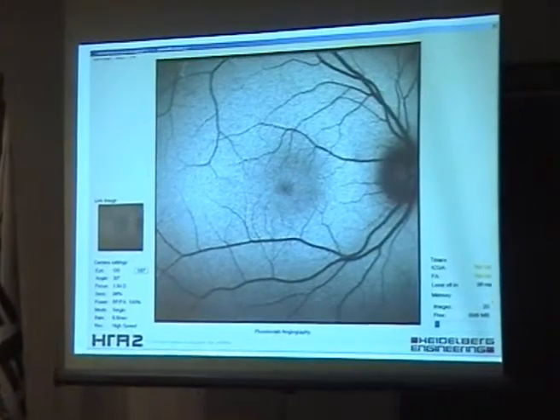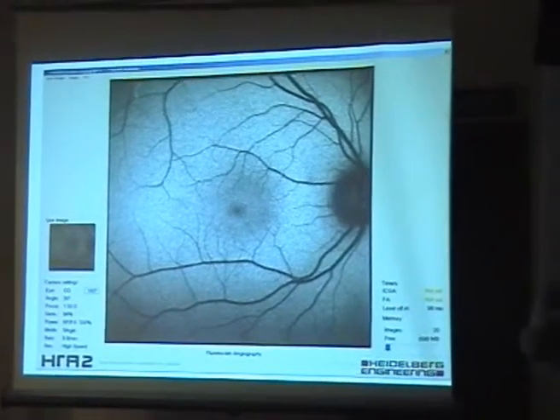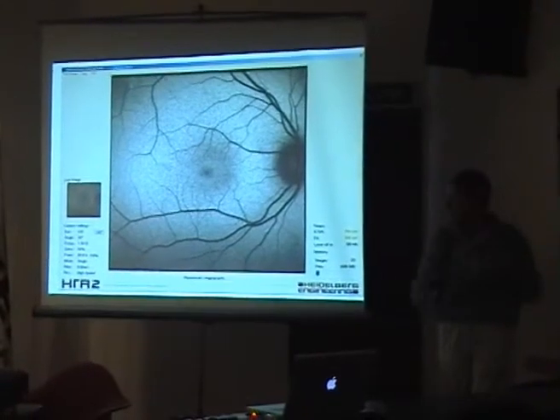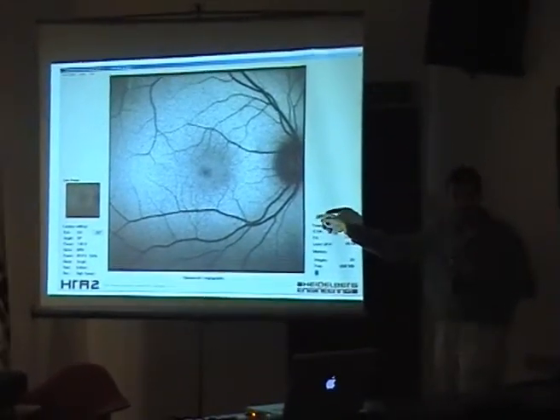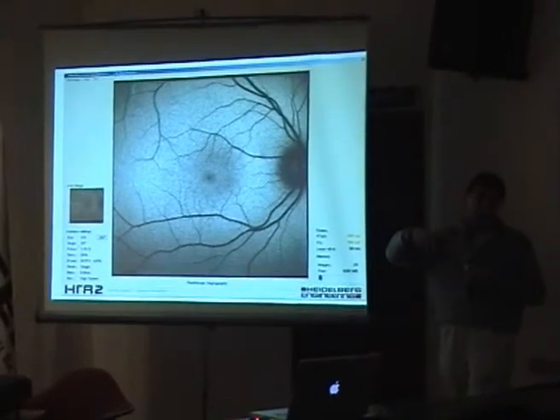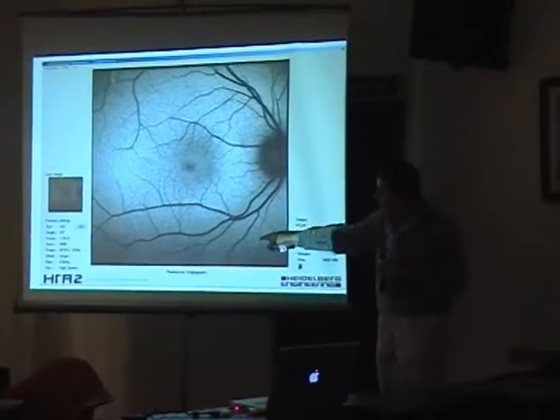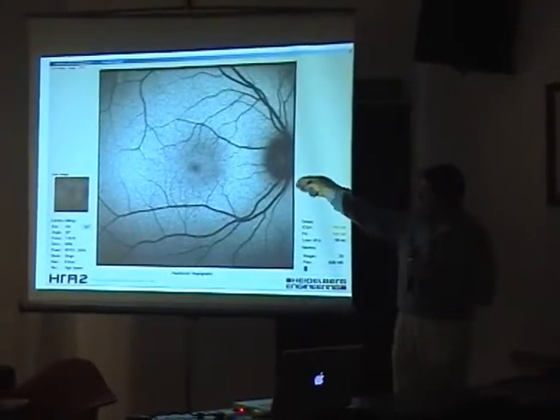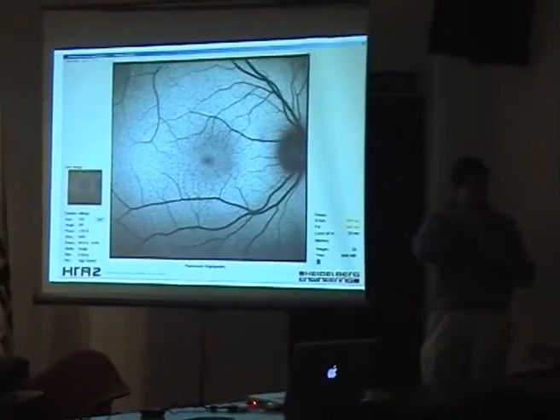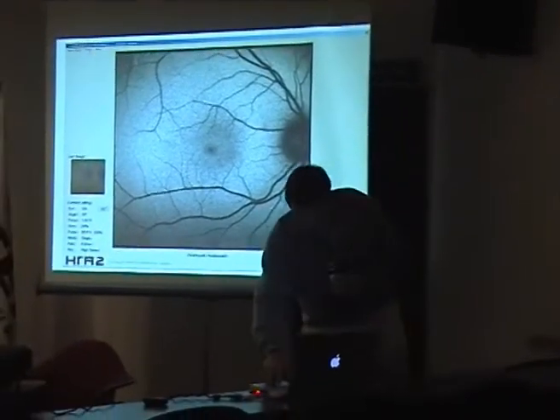Usually you take a movie and then do a mean of 9, 12 images of one short movie with this ART software. Acquisition in real time is actually averaging, and you have a mean image, and you decide to grab that image when it's quite clear and sharp.